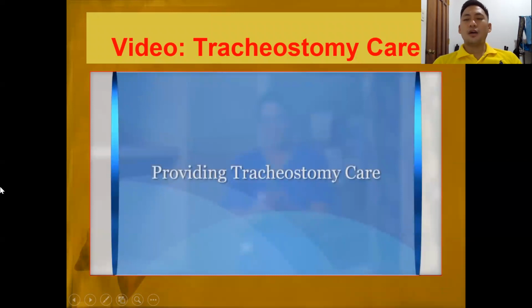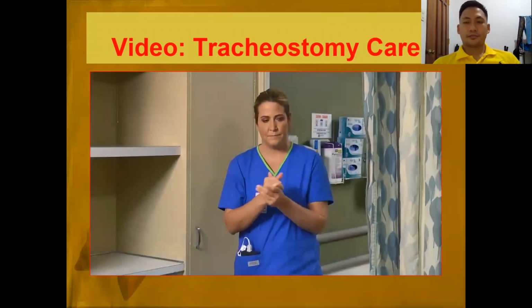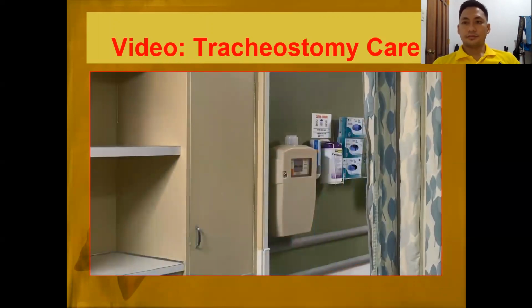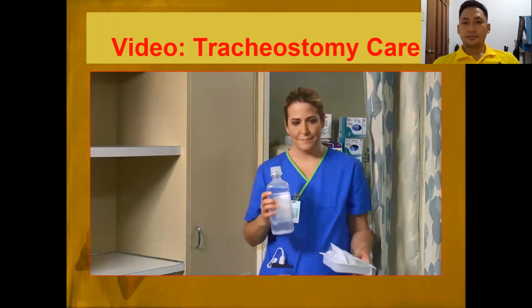So let's see how to do a tracheostomy care. Before providing tracheostomy care, ensure privacy. Perform hand hygiene. Gather your supplies and introduce yourself to the patient.